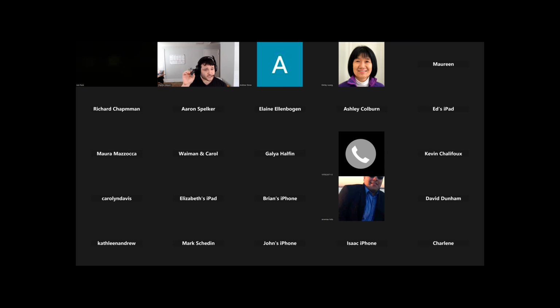What I could have done is clip this little thing, which just looks like a little black rectangle, onto their lapel, and I would have been able to hear them all over the room. There's tons of devices out there, particularly if you have hearing aids, that can interface with them to help you connect.